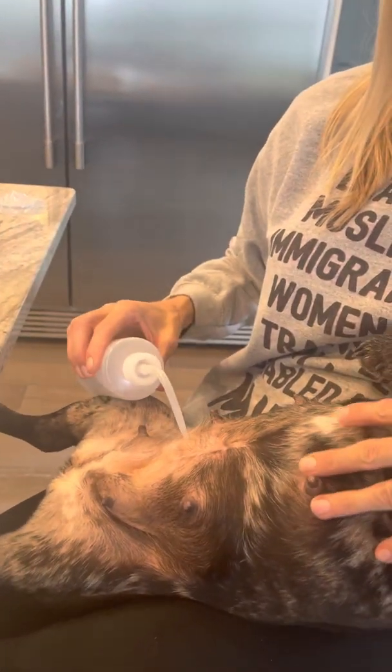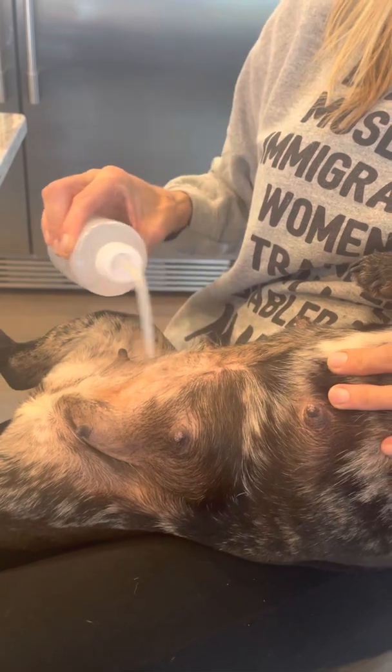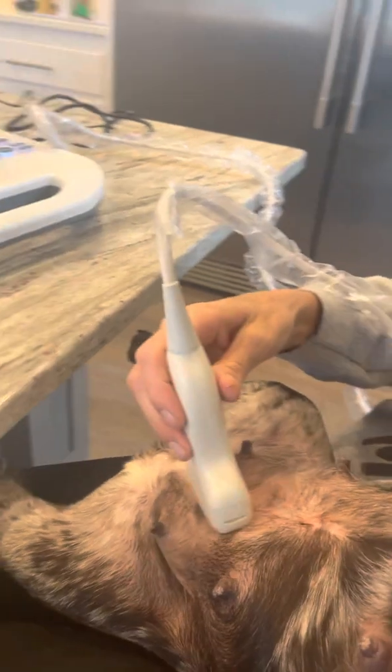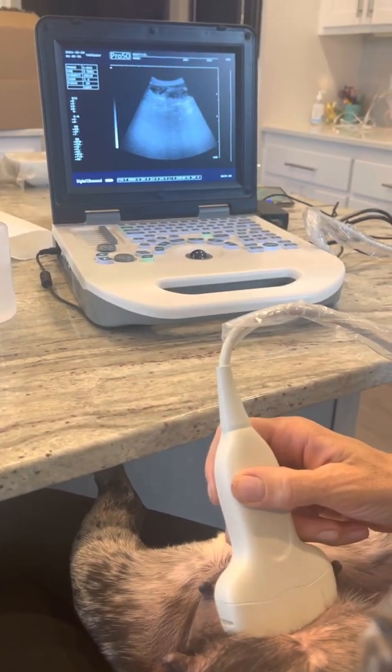What I like about doing an ultrasound at home is I can take my time. We're going to put a little bit of alcohol — it doesn't hurt her at all — and we're going to put the wand right here. And right away, we are seeing puppies.